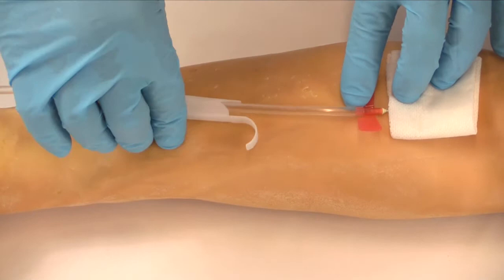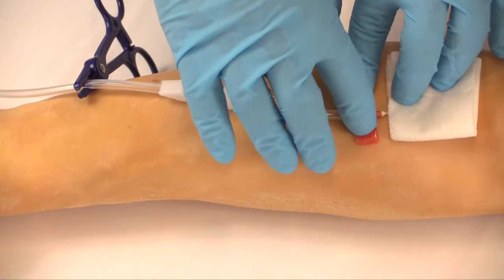As always, refer to your center procedures for taping. Remove any remaining tape. Slide the MasterGard forward with the finger shield pointing up.